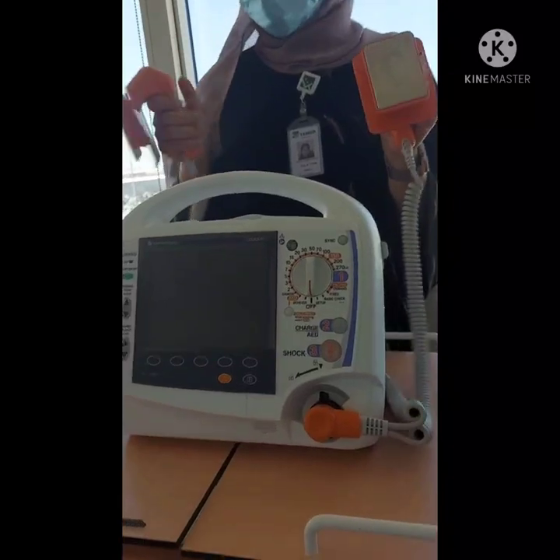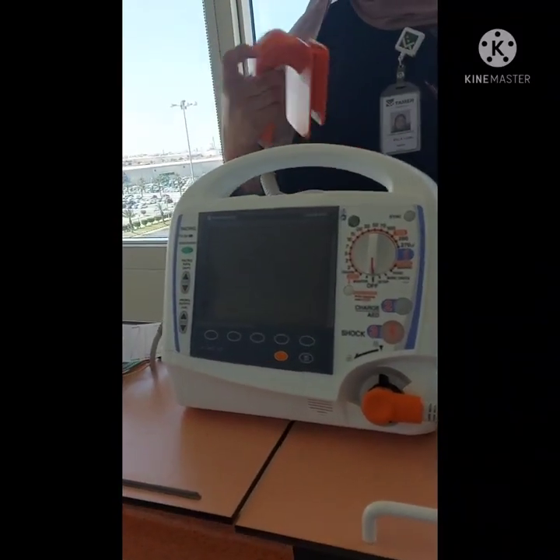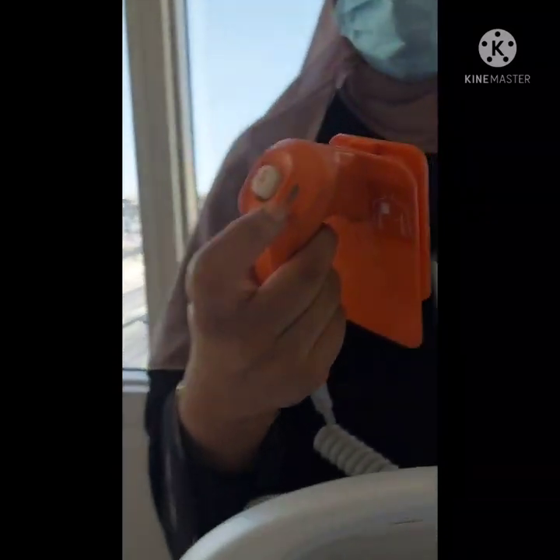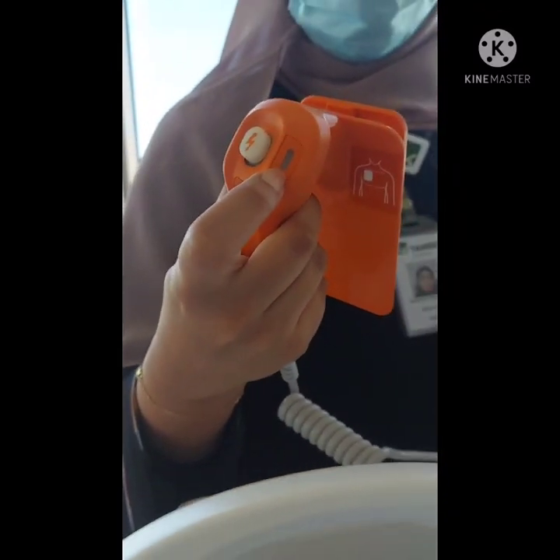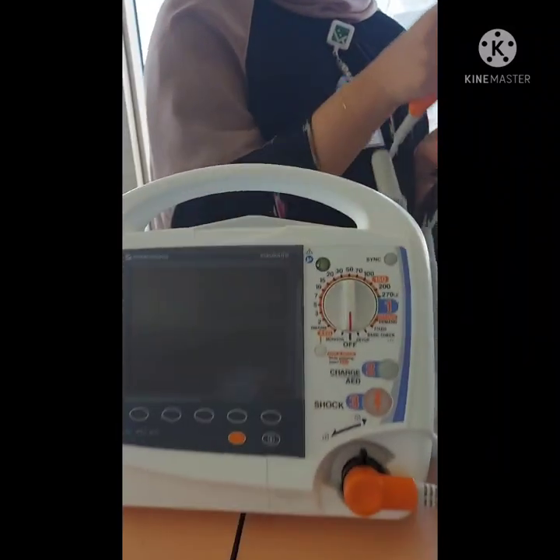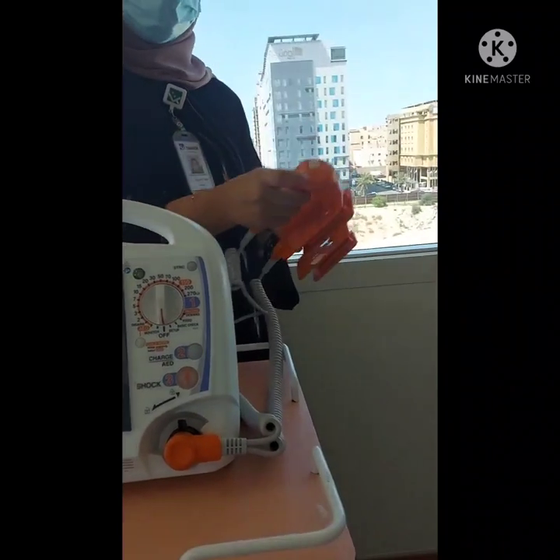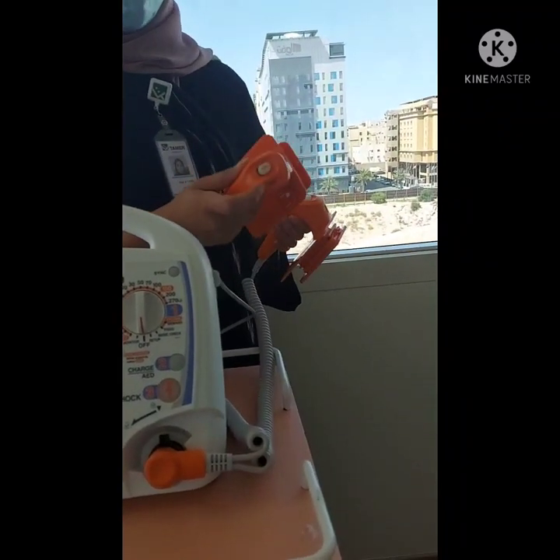Okay. Also, there's another thing I'm going to show you in a minute when we turn on the defibrillator, but it is this one. This is an indicator of contact. So if the paddles are not contacting the patient directly in the right way, it's going to turn red. If it's contacted well with the patient, it's going to be green.